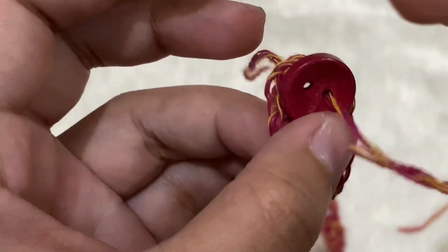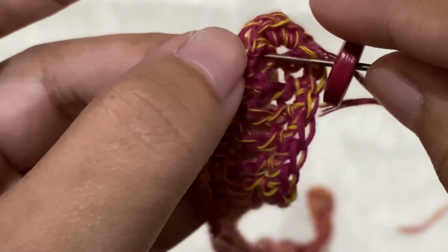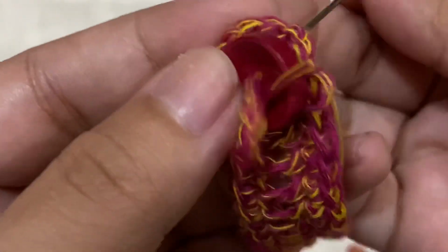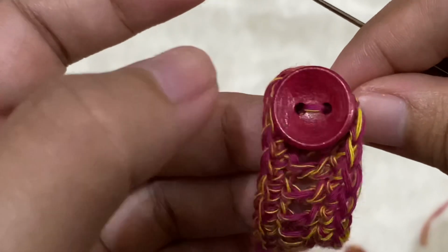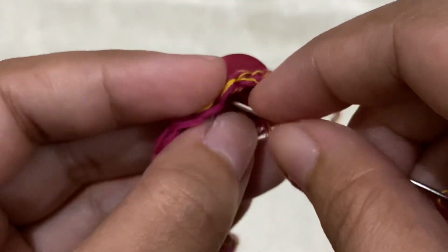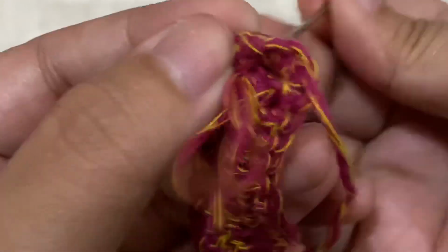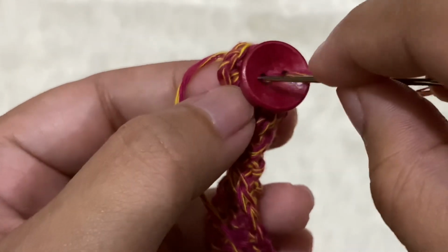Okay, and put it on that buttonhole, go through the other side, other one, and again I want to insert the needle into a stitch right there. I just feel that it's more secure. And make sure that it's really tight, and do the same thing. Okay, so one more round right there, and through the hole. I'm just making sure that it's really tight and secure.